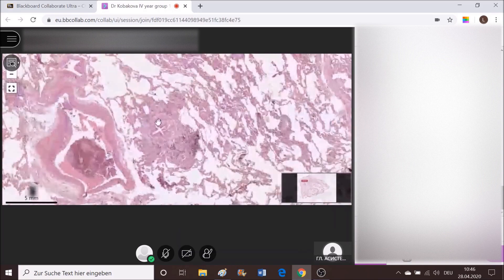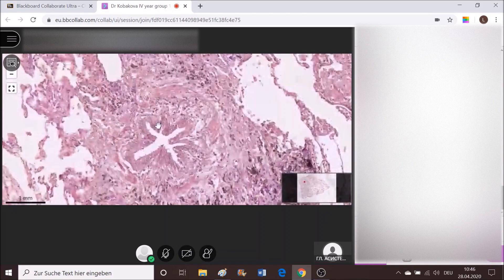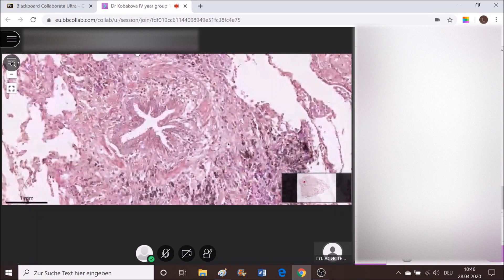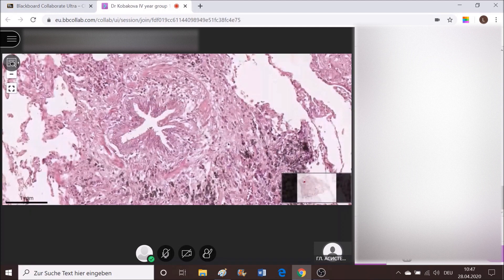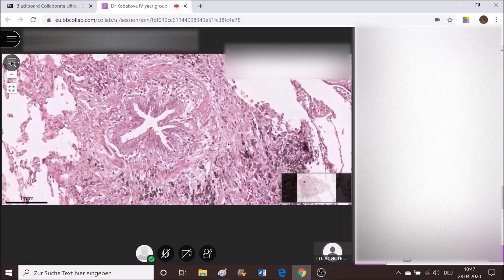Next to it, what is this structure? What is this thing that you're observing here? Star-shaped lumen, no erythrocytes on the inside — bronchial. That's a bronchial.